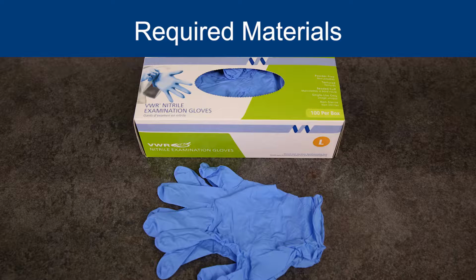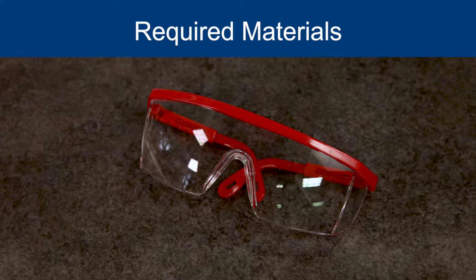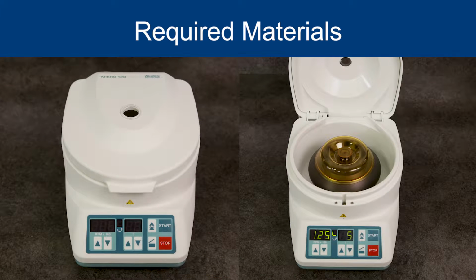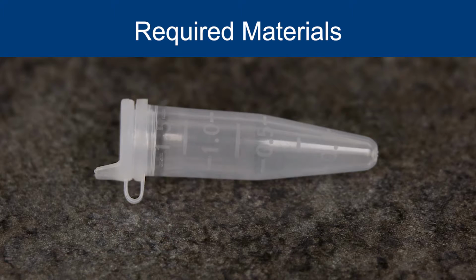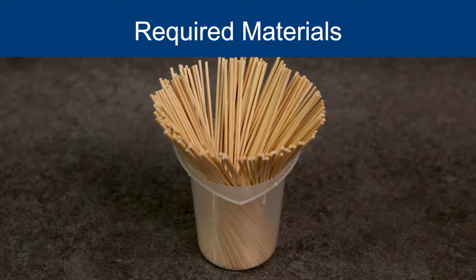Personal protective equipment including powderless disposable gloves, protective clothing, eye protection or face protection, a vortex-type mixer, a centrifuge capable of greater than or equal to 12,000 G, polypropylene or other appropriate centrifuge tubes for specimen dilution and centrifugation with at least 1.5 milliliter capacity, sample transfer pipettes used to measure the appropriate quantity of stool sample for processing, and an applicator stick or loop.